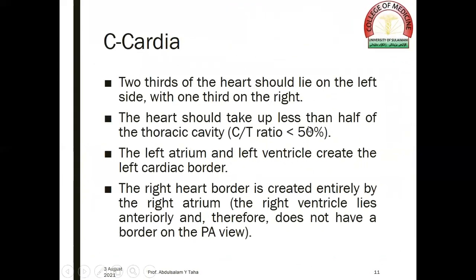C stands for the cardiac. Normally, two-thirds of the heart should lie on the left side, with one-third on the right. The heart should take up less than half of the thoracic cavity — that is, the cardiothoracic ratio should be less than 50%. The left atrium and left ventricle create the left cardiac border. The right heart border is created entirely by the right atrium, because the right ventricle lies anteriorly.